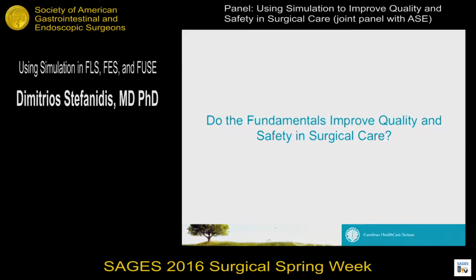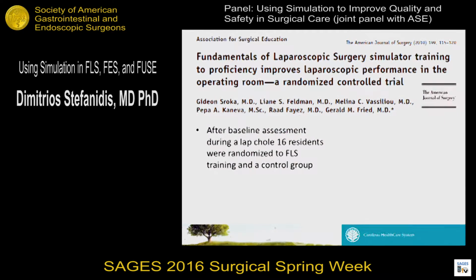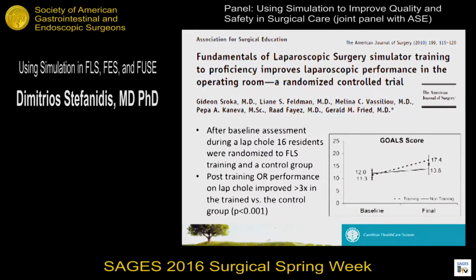So, given the topic of this panel, I will try to address what evidence we have that demonstrates that these fundamentals may be improving the quality or the safety in surgery. I will start with one randomized trial that assessed trainees put through a proficiency-based curriculum using the FLS tasks, and assessed their performance in the operating room before and after the intervention.